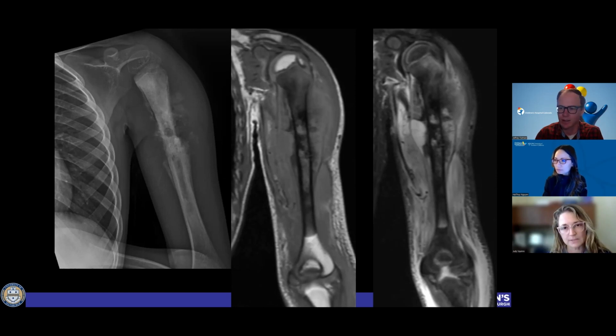So we can obviously see infection. We can see all sorts of things. This ended up being osteosarcoma, just presented first at ultrasound, and then he actually went on to biopsy before he got radiographs and MR.